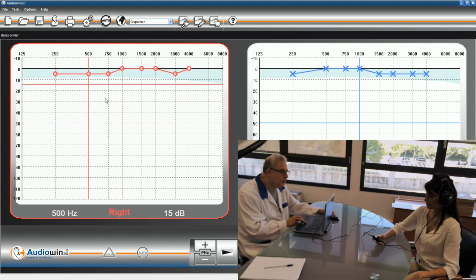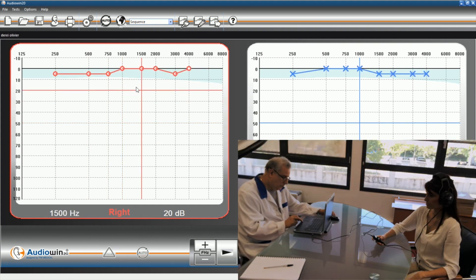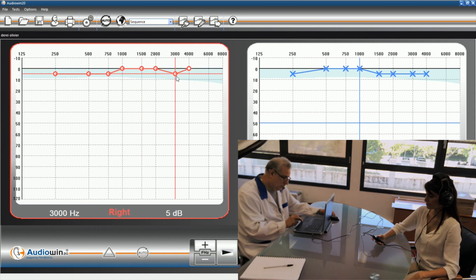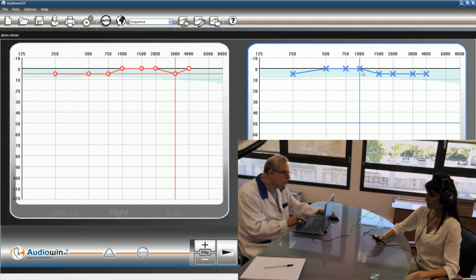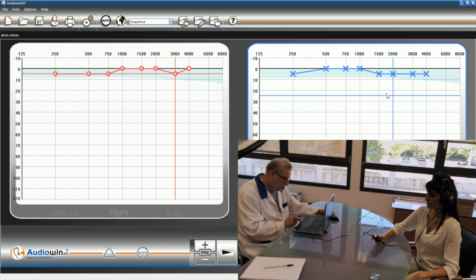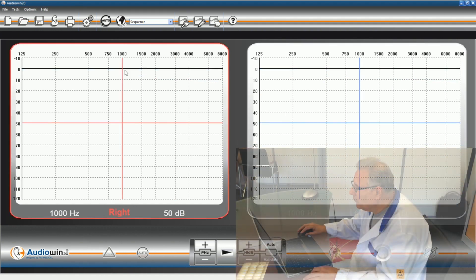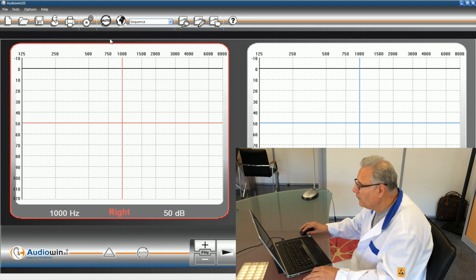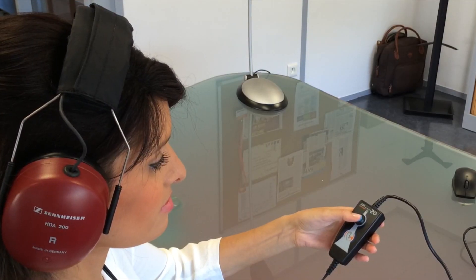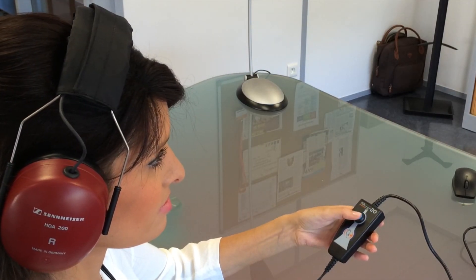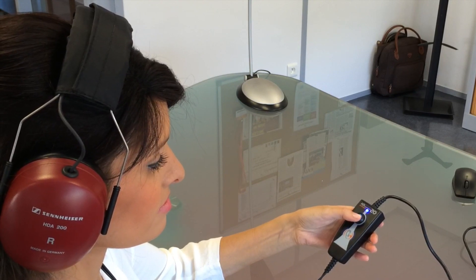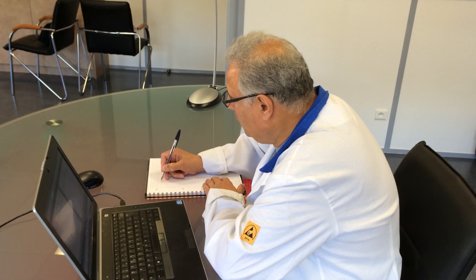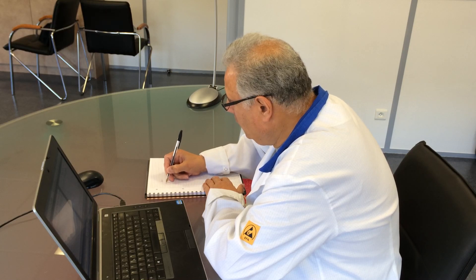The operator may choose to perform a test manually or automatically. For manual mode, select the desired frequency and hit the play button. A sound will be transmitted and the patient presses the button if the sound is perceived. For automatic mode, the operator selects the appropriate multilingual vocal assistant language and clicks the auto button. The patient simply follows the multilingual vocal assistant instructions and goes through the test as usual. No operator is required for the auto test.